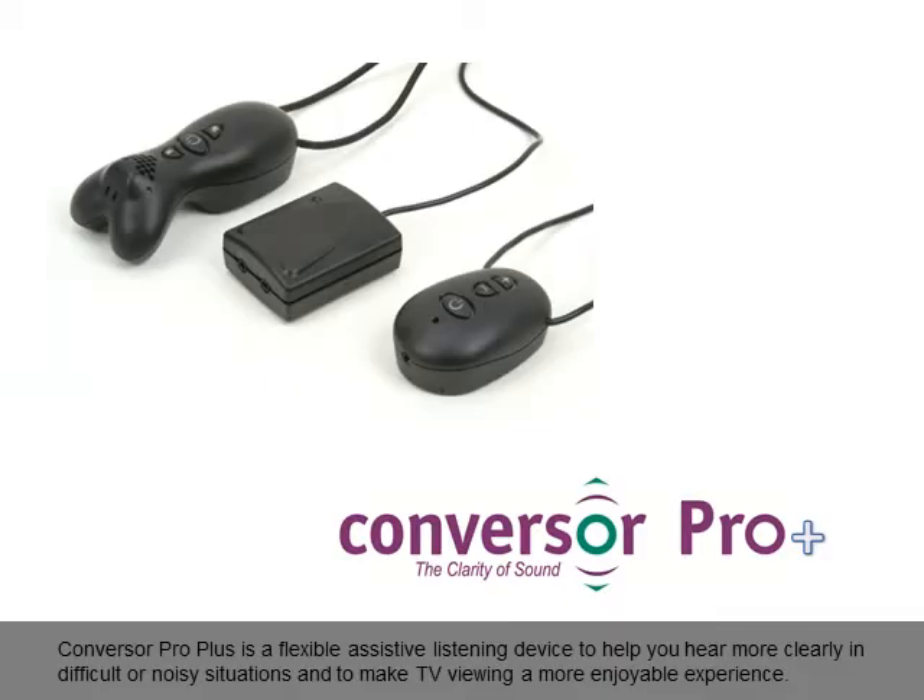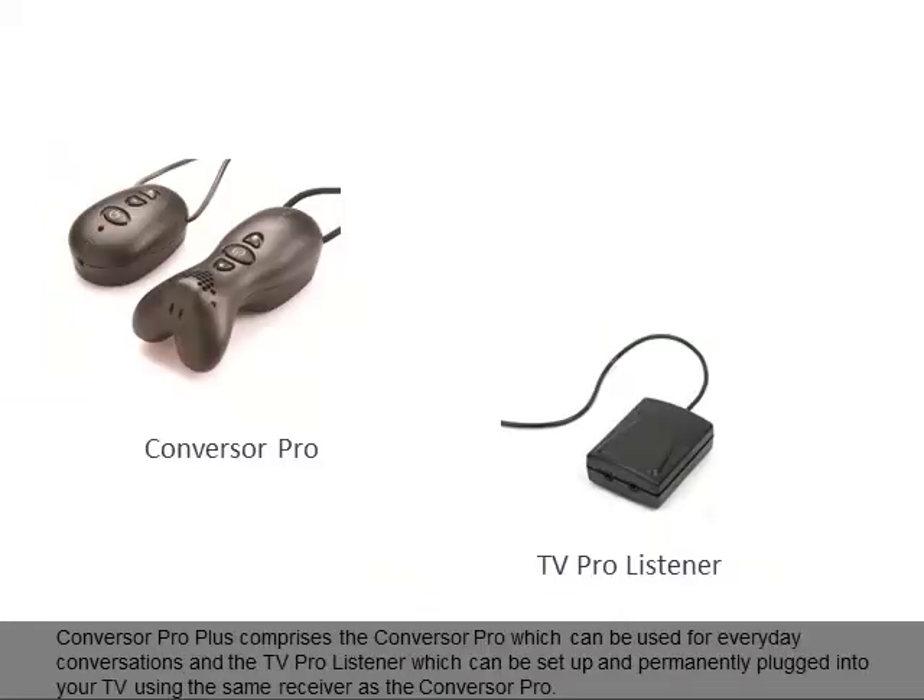Conversa Pro Plus is a flexible assistive listening device to help you hear more clearly in difficult or noisy situations and to make TV viewing a more enjoyable experience. Conversa Pro Plus comprises the Conversa Pro, which can be used for everyday conversations, and the TV Pro Listener, which can be set up and permanently plugged into your TV using the same receiver as the Conversa Pro.